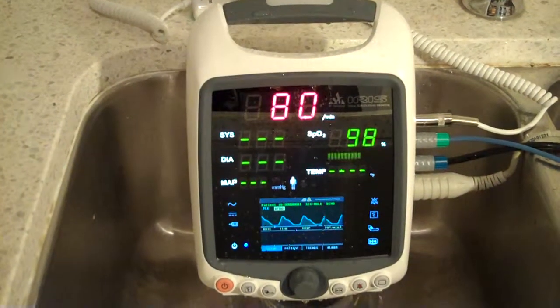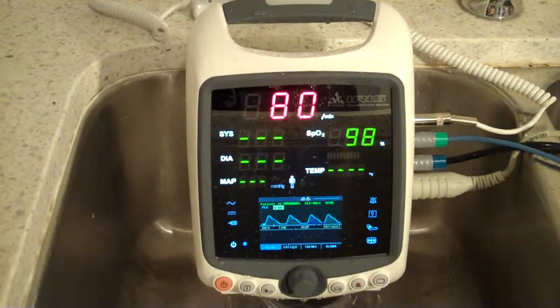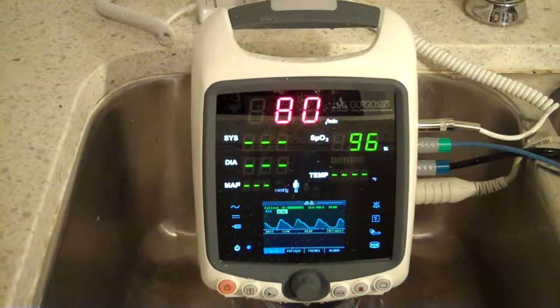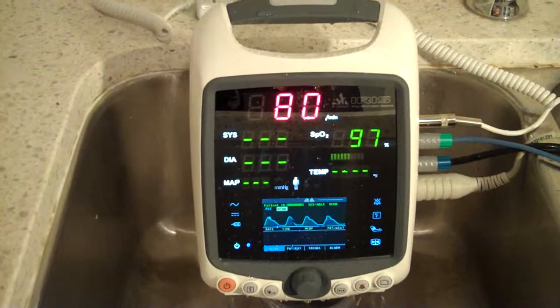This monitor can also resist a 3-meter fall. As you can also see, it's very nice aesthetically, and it has different parameters. There's SpO2, and it measures temperature, blood pressure, ECG, and CO2.